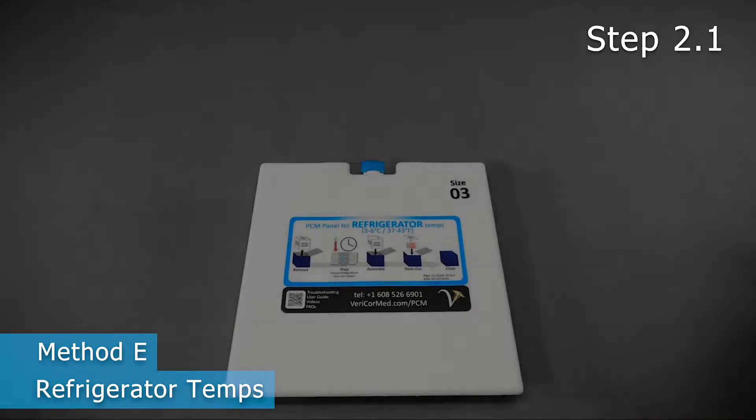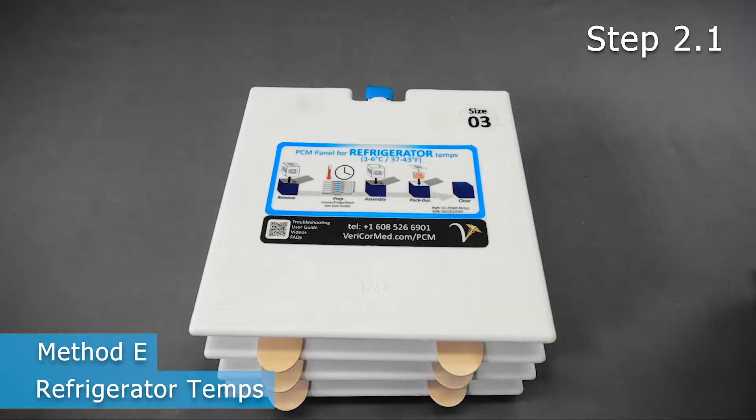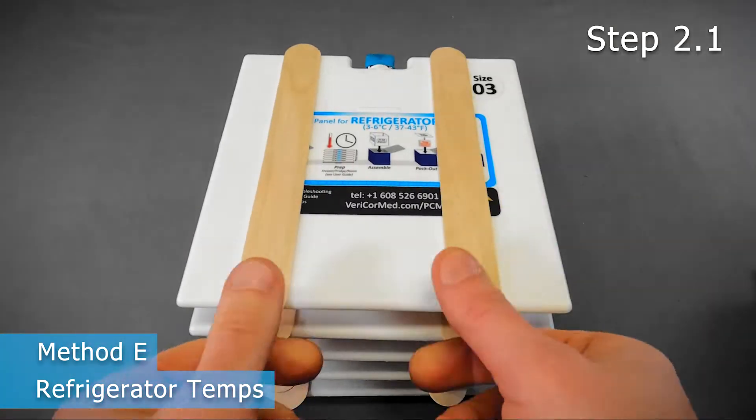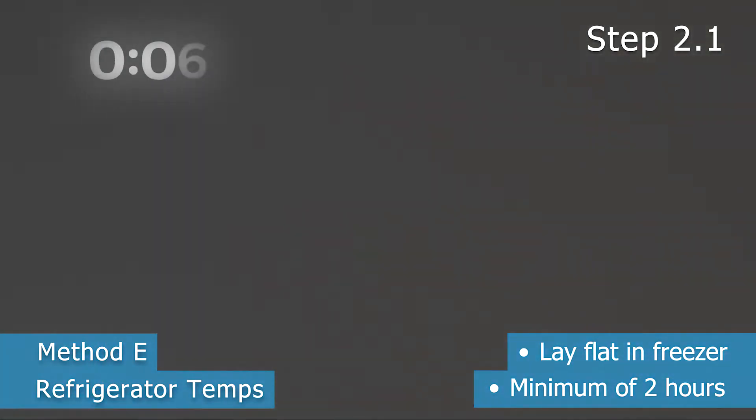If stacking, place something between each panel, such as tongue depressors or pencils, to enable airflow around each panel. Keep the panels in the freezer until the phase change material turns solid. Any freezer will work; however, the colder the freezer, the faster the PCM will turn solid.